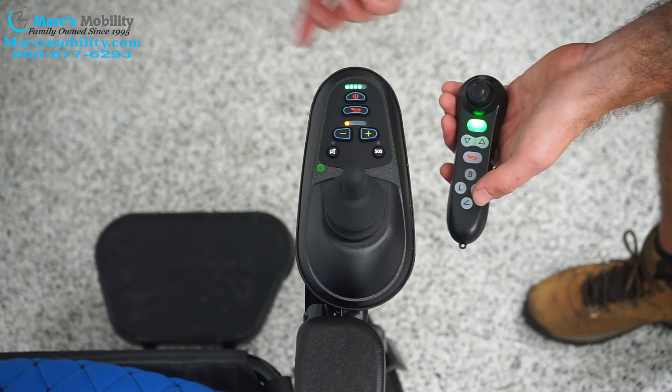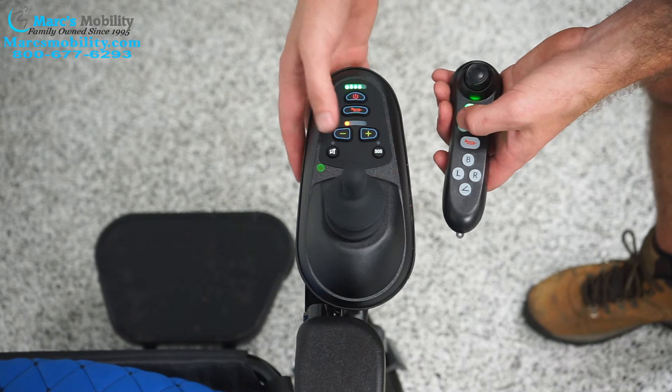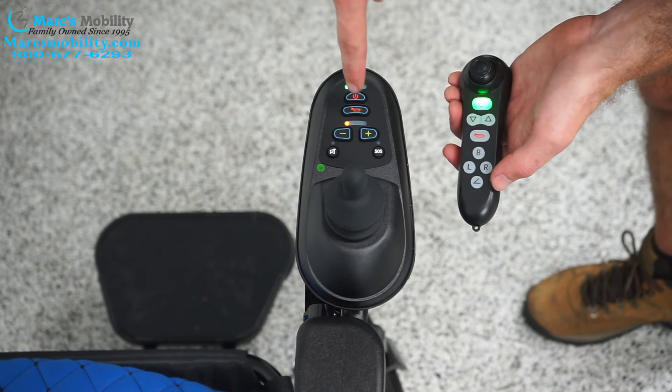I didn't do it in time, so I'm going to have to do it again. But just to show you — you get a single amber light, then this will turn red. You have to wait for both of those things to happen. Once you get the single amber light and once you get the red light on here, you're going to press the horn button.